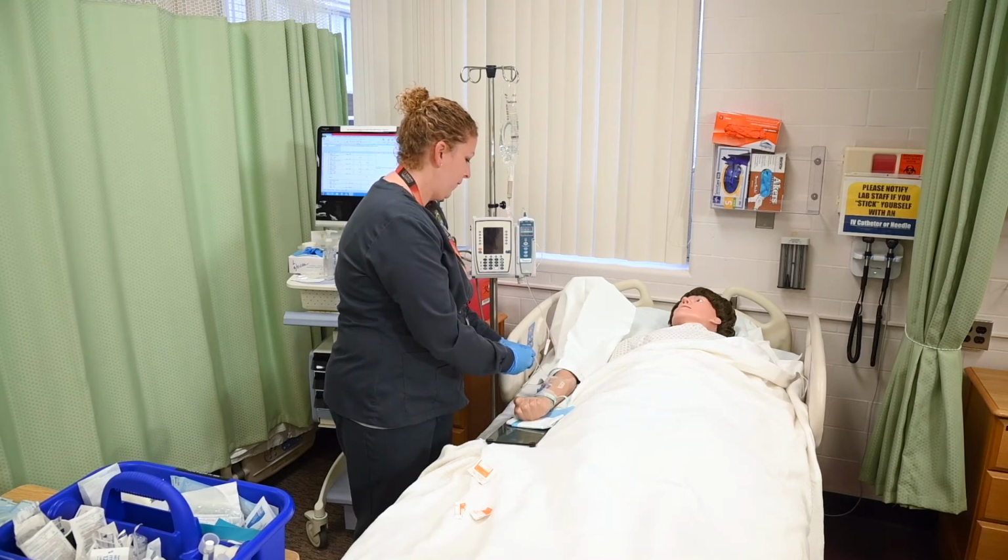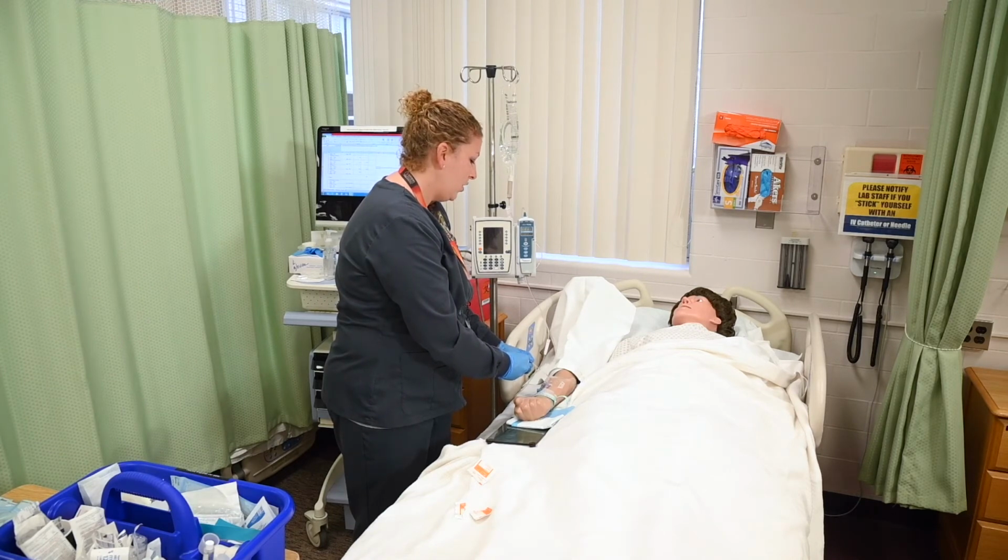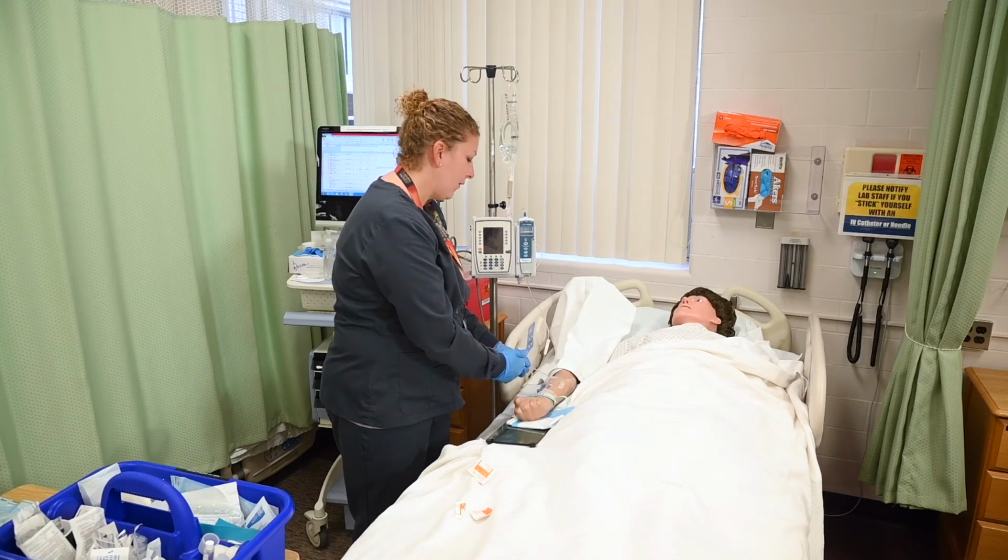So she's going to be watching the clock again. I'm pushing my first 3 mLs by injecting 0.6 mLs every 30 seconds, watching the clock. My first 3 mLs has infused. Now I'll push the last 7 mLs of the flush at a slow and steady rate.